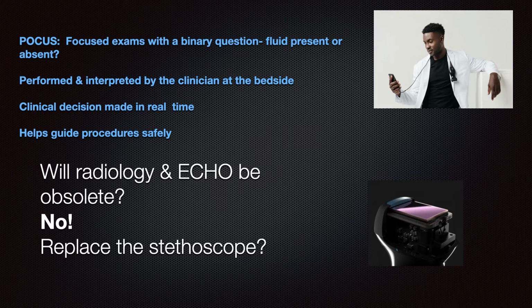There's jokes about the stethoscope now being the wheeze detector, meaning that point-of-care ultrasound can't detect wheezes, but I actually find that both complement each other, and I'll listen to the chest or the heart, and then I'll follow it up with ultrasound, and I think both bits of information are helpful in making a diagnosis. And it's also going to enhance your physical exam as well.